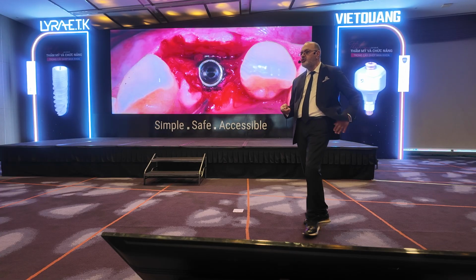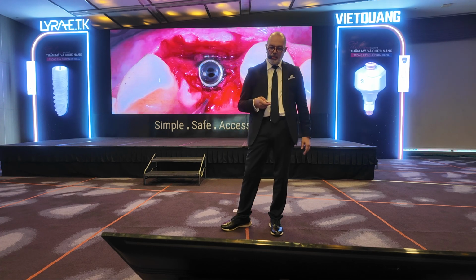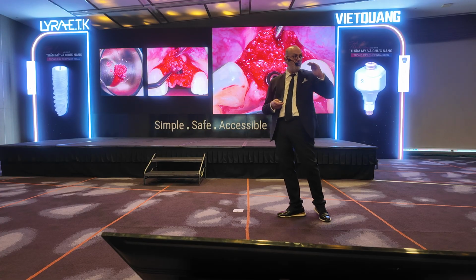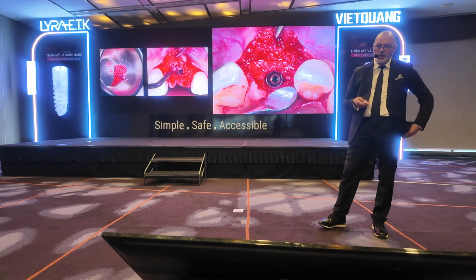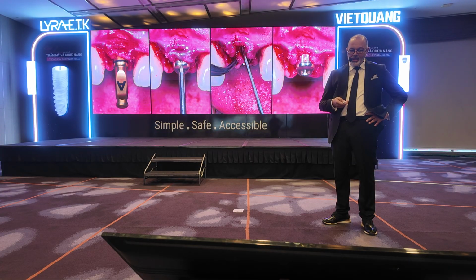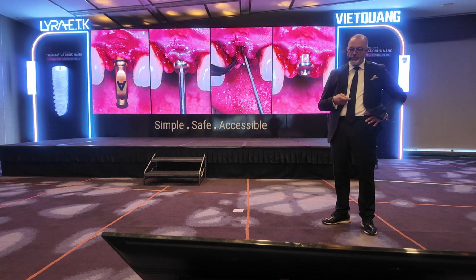We are almost inside the bone. We have a dehiscence on the buccal part. We decided not to elevate the flap. We just make a kind of pocket, and we fill up with artificial bone and PRF for sure, and immediately we try to play with the two papillae by having a first incision slightly in the palate.